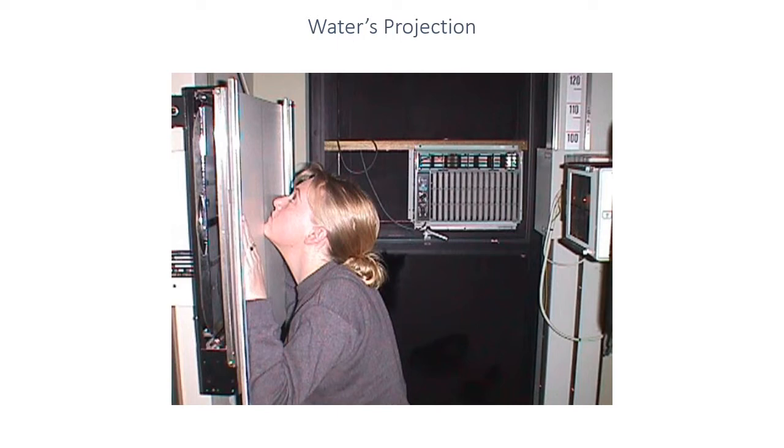Now, one of the things about the Waters projection is that when you are performing this series, you need to take multiple Waters projections with the patient in the same position. One of the things which I would advocate, therefore, is to communicate with your patient, let them know that you're going to put them into a particular position and that you would like for them to stay in that position whilst you perform 1, 2, 3 images in a row. The tube angulation is going to be the only factor that changes and correspondingly the image receptor, but otherwise the patient position stays the same. So you are essentially going to be convincing the patient to stay in an uncomfortable position for a couple of minutes.